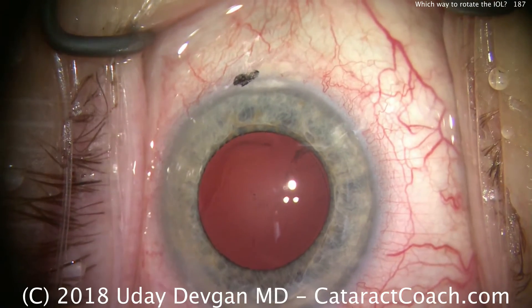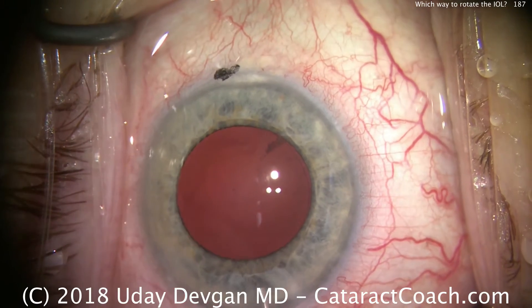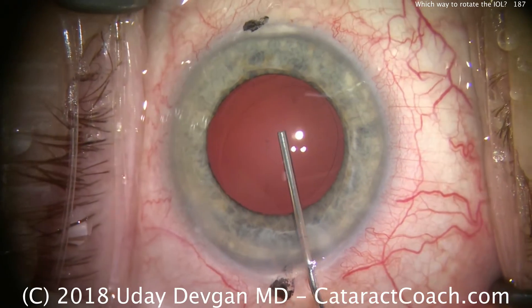It's Cataract Coach, and today we're asking the question: which way should you rotate the eye well? Clockwise or counterclockwise? And the answer is, it depends.